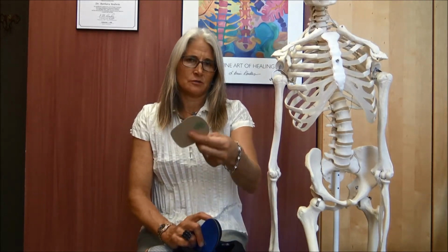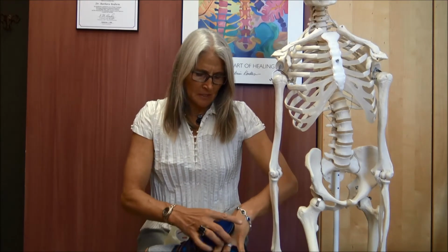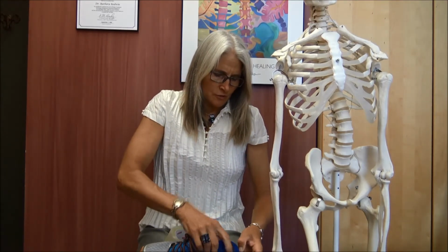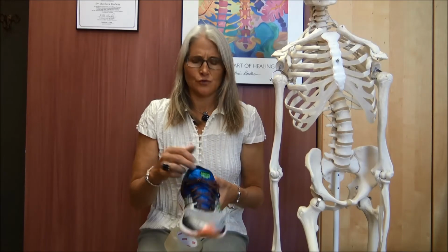The wide part goes to the back, cork facing down, and then you put your insole back in. That way when you put your foot in your shoe, it doesn't slip forward.